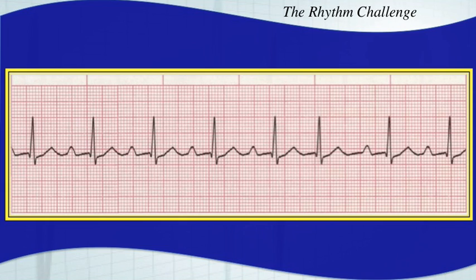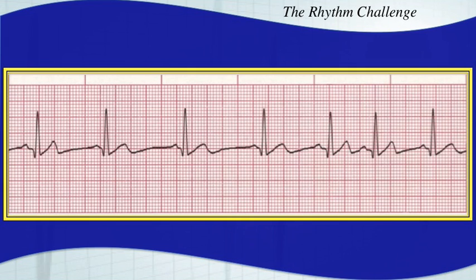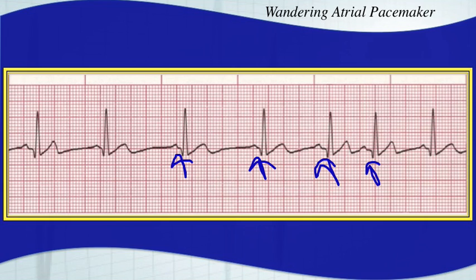This one is a sinus rhythm with a first degree AV block — just a little bit of a prolonged PR interval. And this next one is a wandering atrial pacemaker. Note the morphologies of the P waves. Since it's slower than 100 beats per minute with several different morphologies, it's called a WAP — wandering atrial pacemaker.